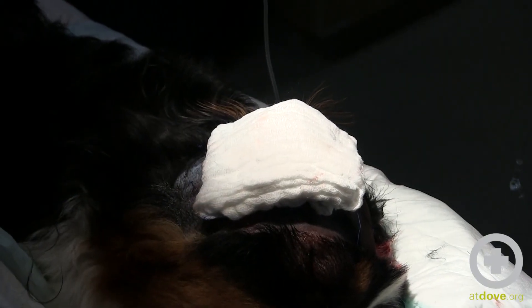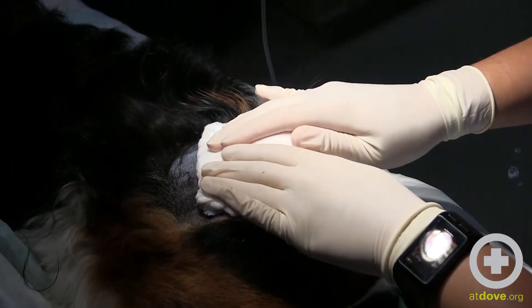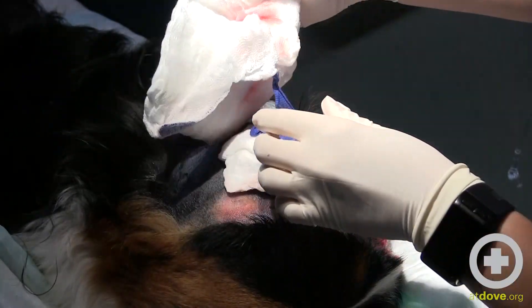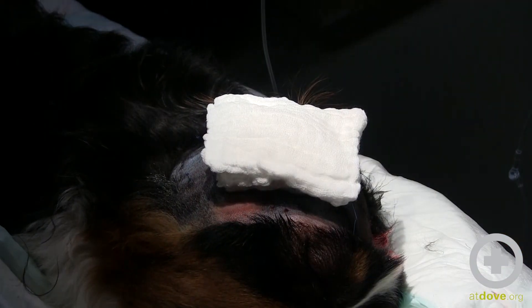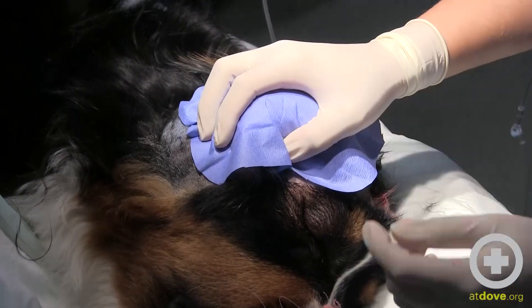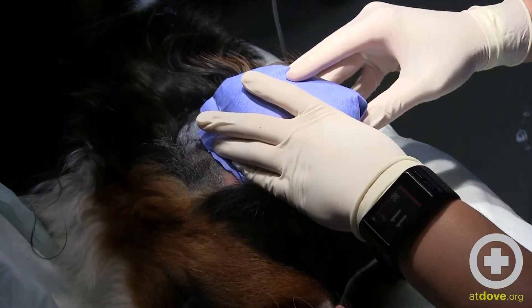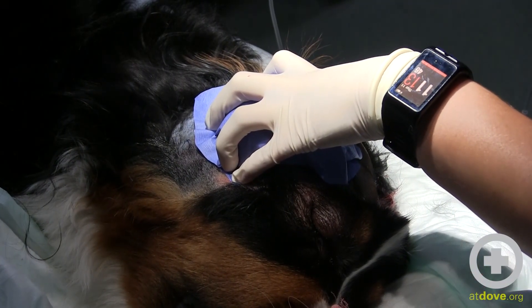Now that we have our stay sutures placed, I want to cover this with something both for cosmetic appearance and also to protect it a little bit. As I'm touching this top lap sponge, I notice it's already a little bit wet, which is to be expected. Since I have a pack open, I'll go ahead and replace this top pad before we suture it in place so it's as dry as possible. I anticipate this bandage will need to be changed tomorrow and probably daily for the first three to five days. I like to cover this with some type of impermeable or waterproof substance — drape material works really nice. It's like a little package right on the side of the face. I've pre-cut my umbilical tape.